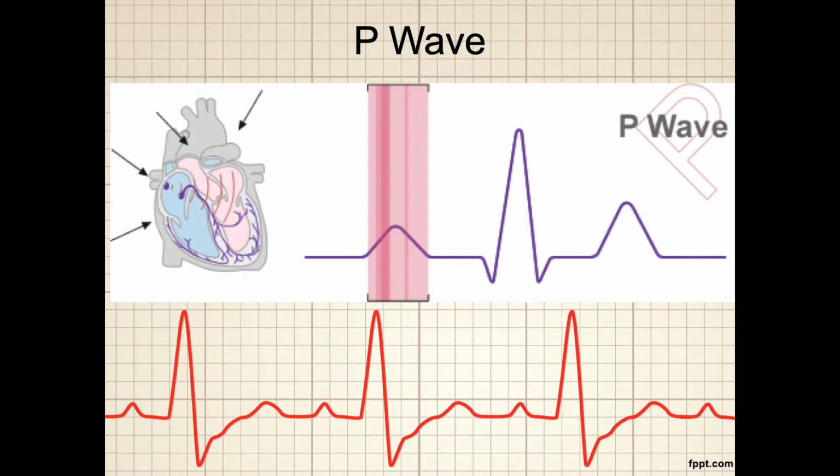You should consider the waves of an ECG to start when the deflection leaves the isoelectric flat line and goes either up or down. And then that same wave comes back down to, or back up to, the isoelectric line. Here, notice the shaded area. It is the entire up part of the wave and the downward part. That is the P wave.